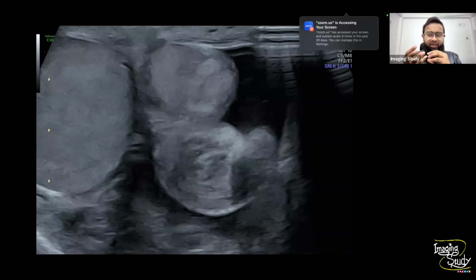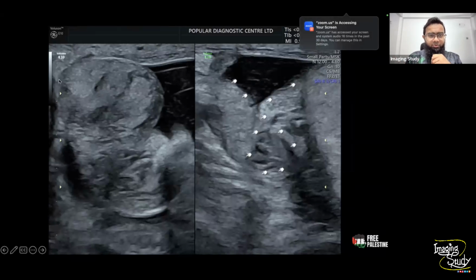But fortunately, it got resolved by itself. So that's why the patient is having a very normalized situation right now about the vascularity of the testis. So this is the area. You see the epididymis is going here, now making a twist at this point and then going here. So it's obviously a risky situation.